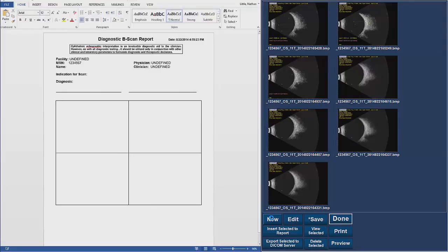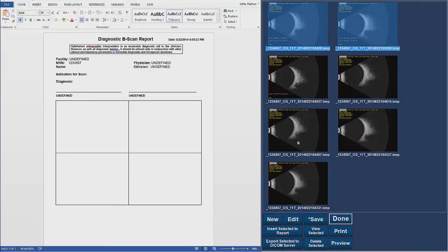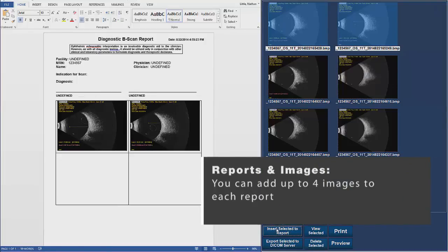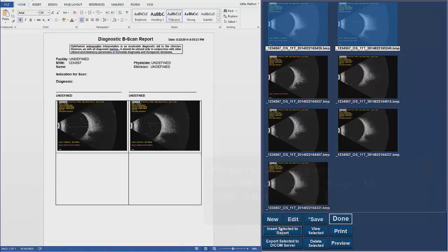In this document, you can type a diagnosis, indication for exam, and import your images. Select the image from the right hand side of the screen that you would like in the report and click on it. The image should become highlighted in blue — then click Insert Selected to Report. The image will be moved from the library to the report. You can continue this with up to four images. Once the desired images are in the report, click the Save button at the bottom of the screen and the report will be saved and exported if this function is set up.